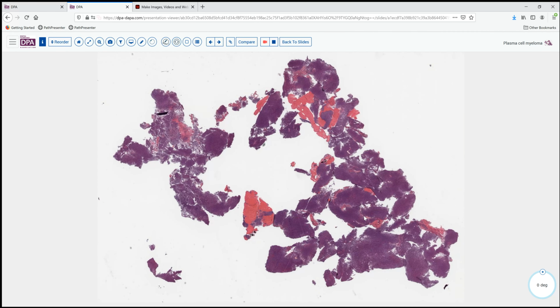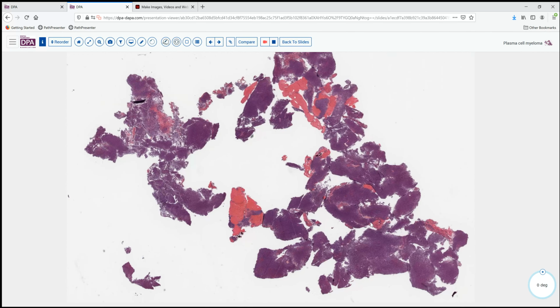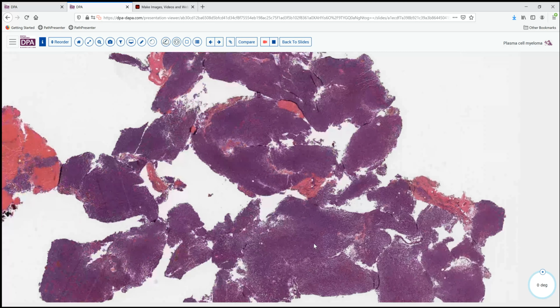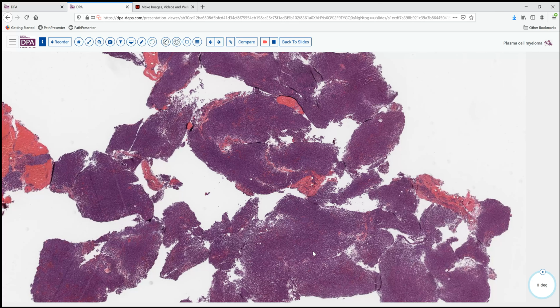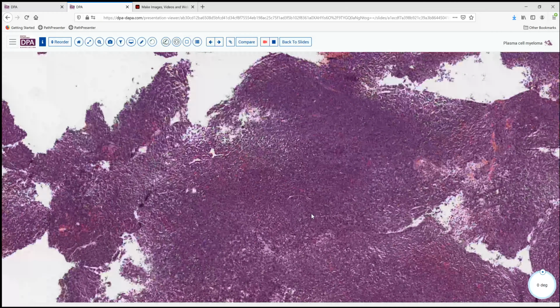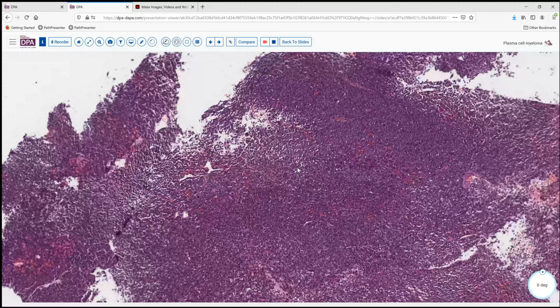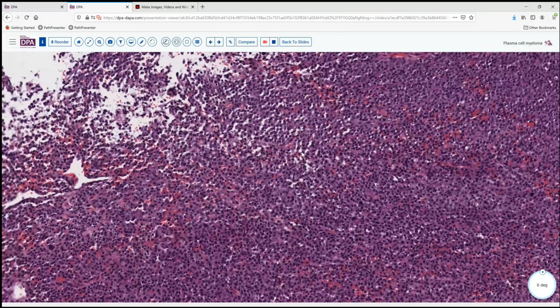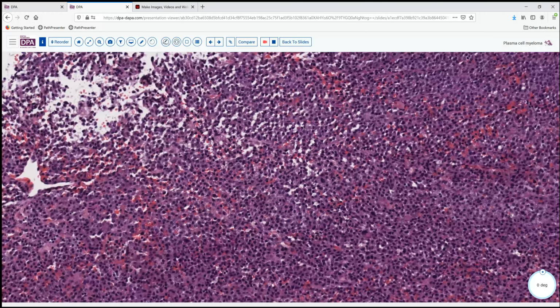This is a representative tissue section from that sample. As we see, it's a very diffuse pattern, very bluish purple with mostly solid appearance and no real defining architecture other than a degree of vascularity associated with some hemorrhage. Going to higher magnification, we can see that these cells have slightly purpled cytoplasm, and honing in on the nuclei, we can see even at this magnification that they are really quite round, very rounded and uniform.